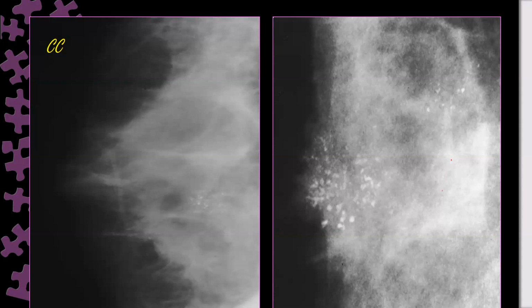The other one for the same patient, Victoria? Yes, same patient. Showing the other, I think it is also CC view. What is the difference between the two views? It is compression magnification. Yes, you have to tell. This is a CC view, and the other one is a spot magnification or compression magnification view.